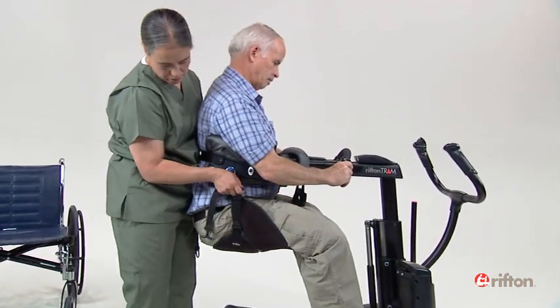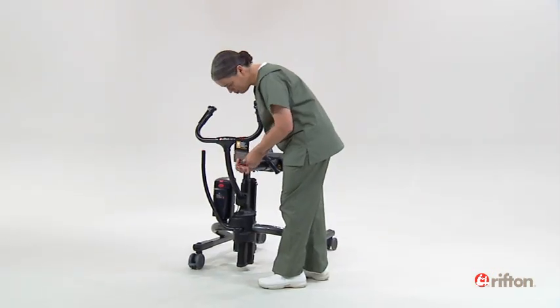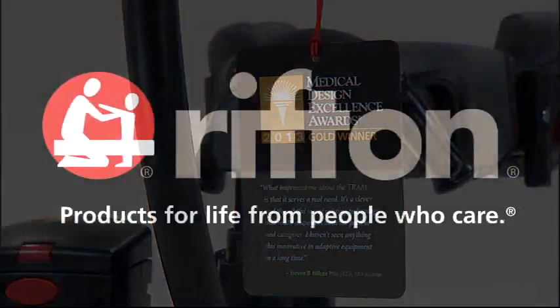All right, how's that? Good? The Rifton Tram — award-winning design to help you lift, transfer, and ambulate your clients safely.